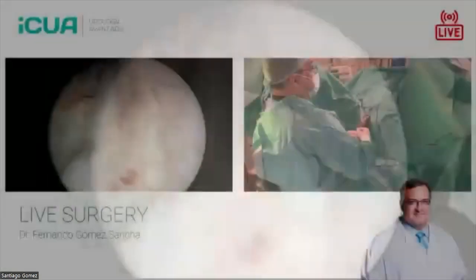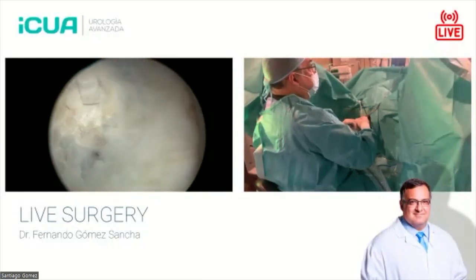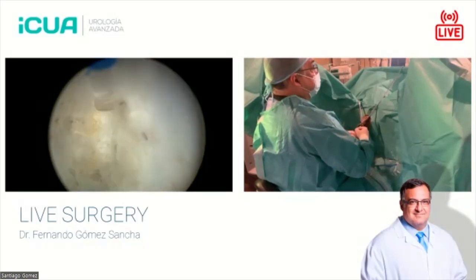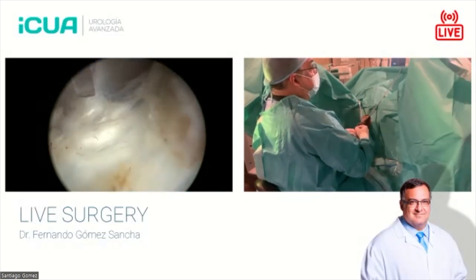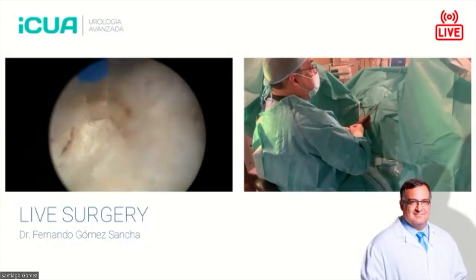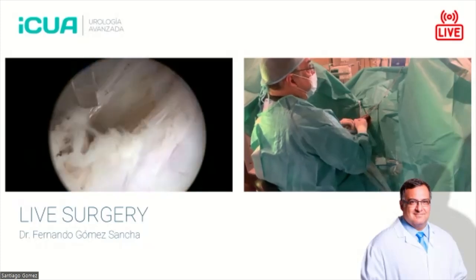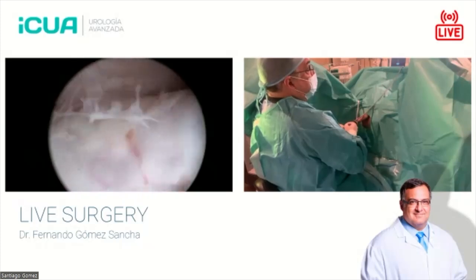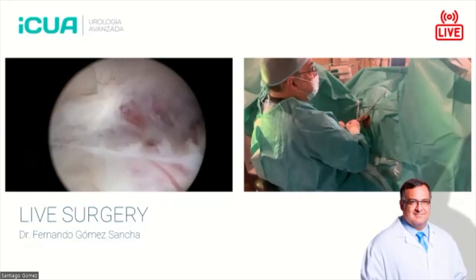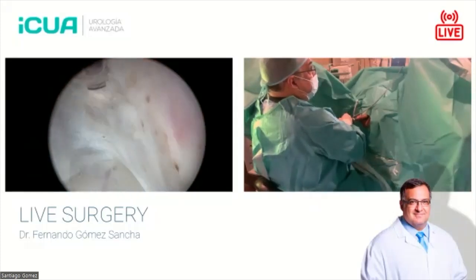So to me, keeping the fiber still gives me a lot of control, and I can decide if I fire against the line, inside of the line, or outside of the line. It's also not confusing at all because I don't have to rotate the camera or the fiber. My advice to people who are learning is to try to keep the fiber in your fingers. I'm holding the fiber with my fingers. And try to move around the adenoma, following your line.